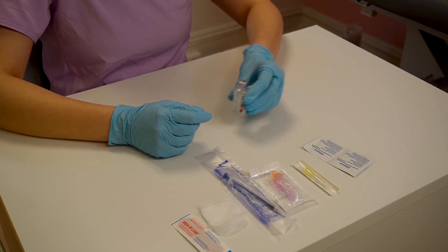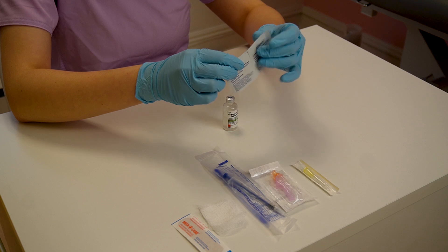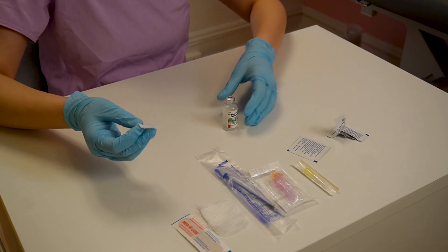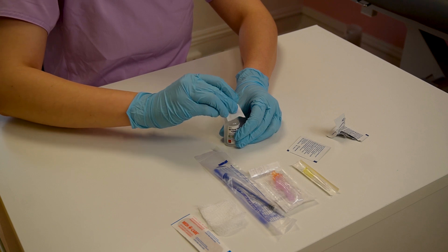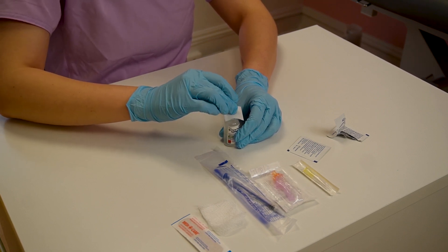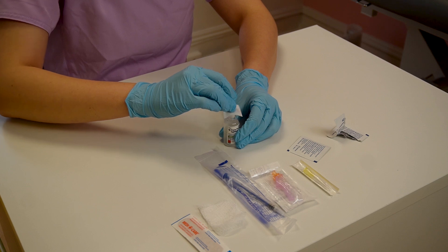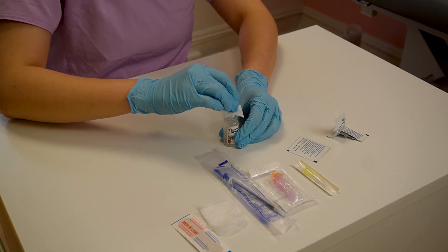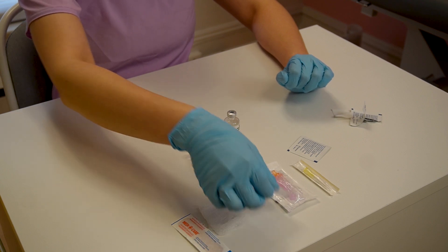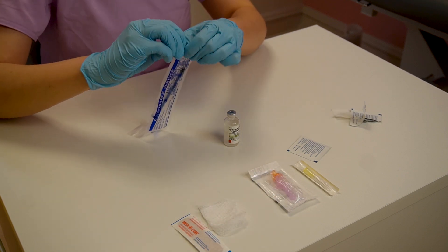Let's clean our testosterone bottle first — in this example we're using testosterone, but we can always use estrogen too. You just want to make sure that we're cleaning this rubber part here for about 30 seconds or so. You don't need to clean the whole bottle. Once that's done, just let it dry a little bit. Now we need to unwrap our syringe.